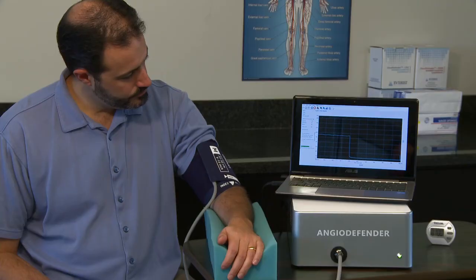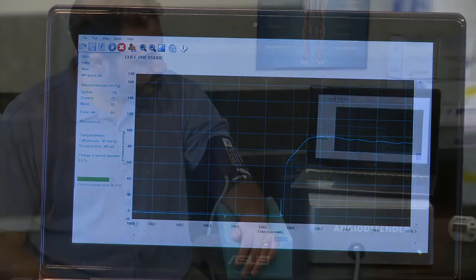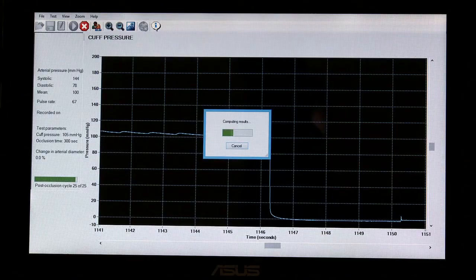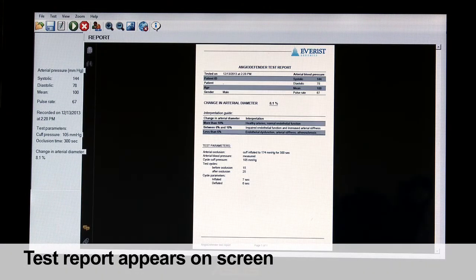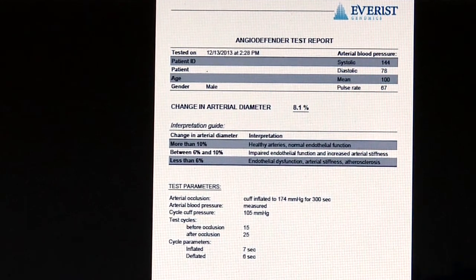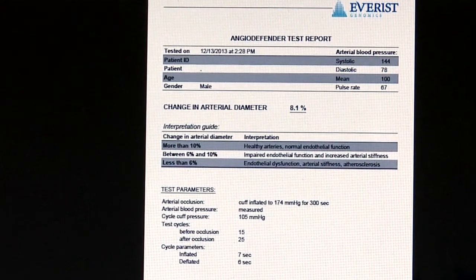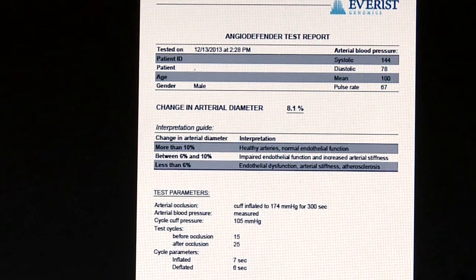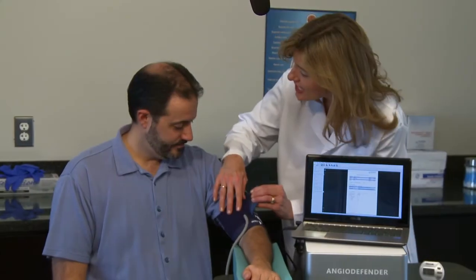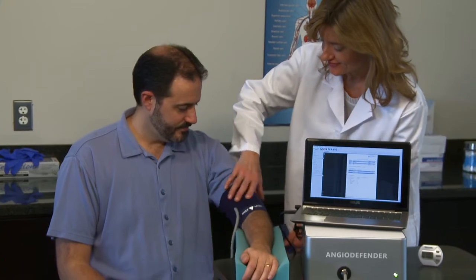After the completion of these 25 inflations, there is a delay of several seconds followed by the appearance of the test report on the screen. The report displays the patient's percent of flow mediated dilation as a percent change in arterial diameter. It also displays the patient's systolic, diastolic, and mean arterial pressures, pulse rate, and patient information entered prior to testing. The cuff is then removed from the patient's arm and the test is complete.